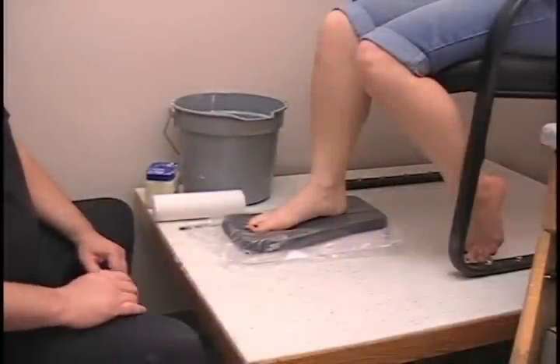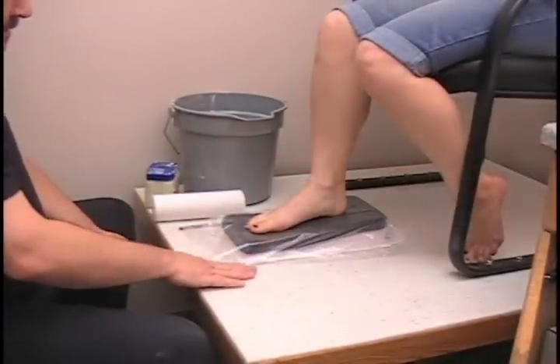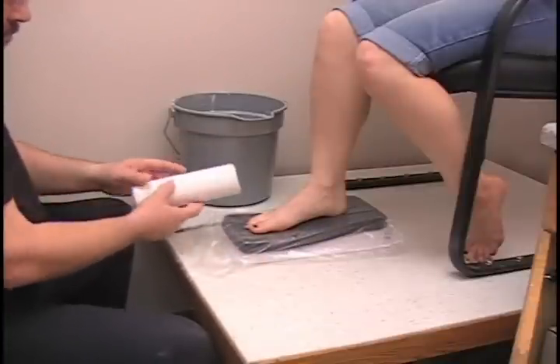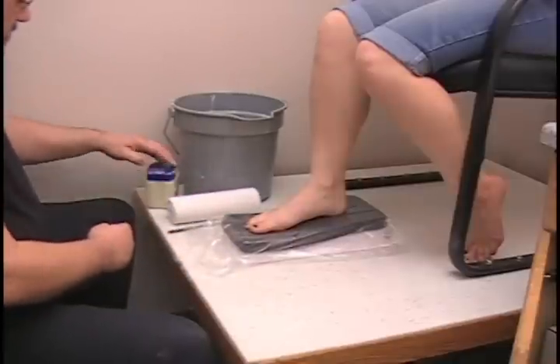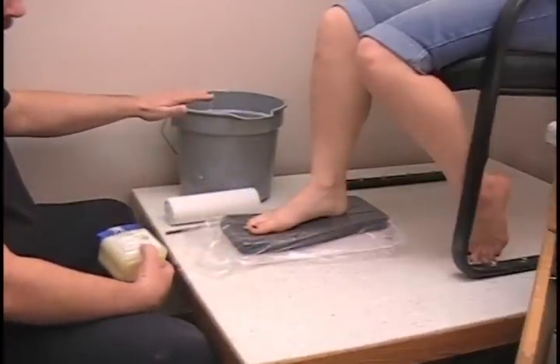This method is preferred for most patients. However, do not use this if the patient has severe hammer toes or bunions. For this casting method we are going to need a solid chair, a casting block with some sort of plastic cover over it, a double pencil, a roll of 8-inch plaster of Paris bandage, some sort of separant — this is petroleum jelly — and a bucket of warm water.